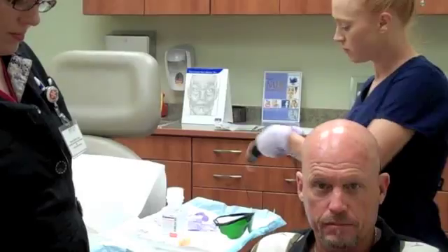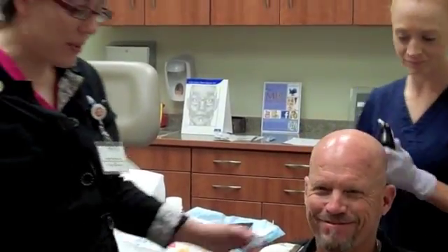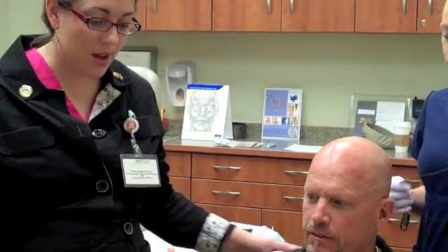There is his little on/off switch that he is in charge of. Now a lot of our patients also bring something to help keep their mind off it, so he has his iPod with him. You are welcome to listen to your iPod the entire time.